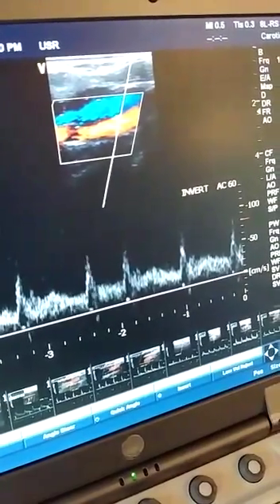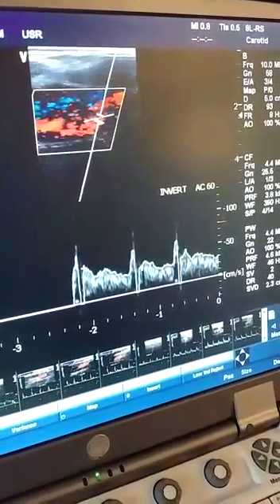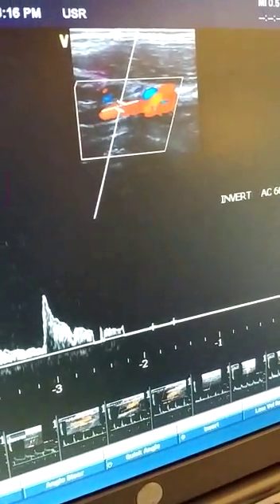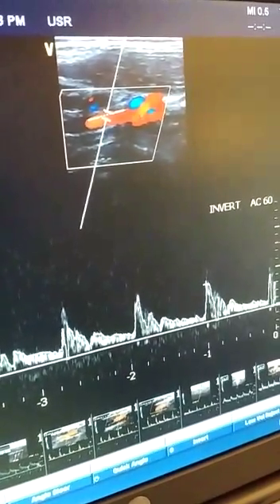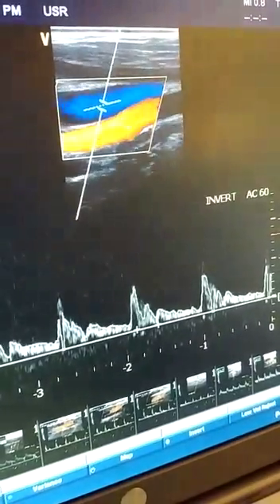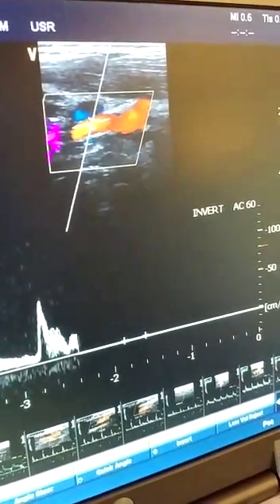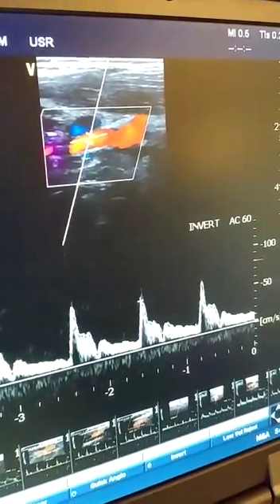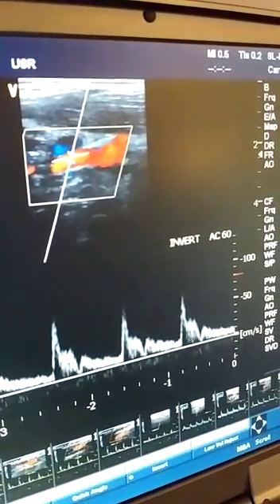You can see that again — that's your low resistance waveform pattern in the ICA. As opposed to the ECA, I'm going to go ahead and go live into the ECA just so you can see the difference in waveform. I'm going to turn down my color gain, and you can see the difference in waveforms between your ICA and your ECA. The ECA waveform is very high resistance.